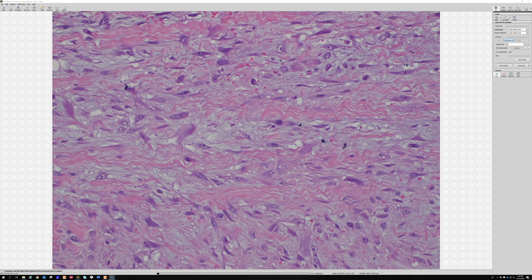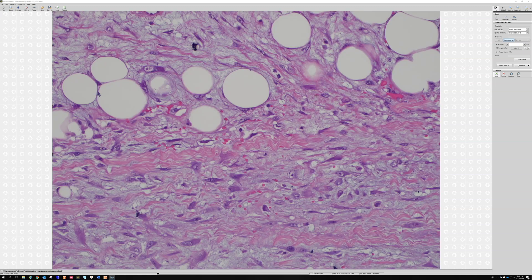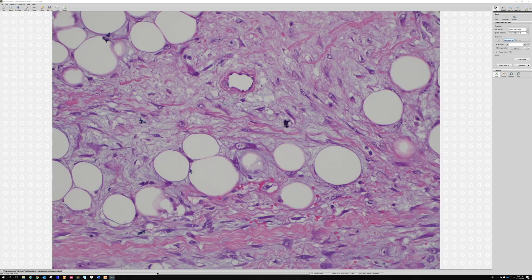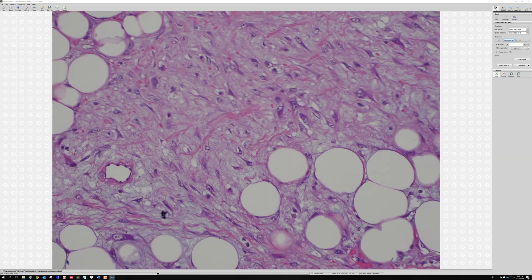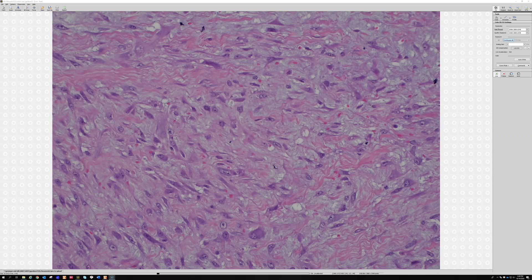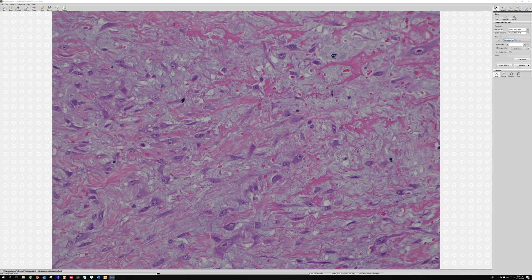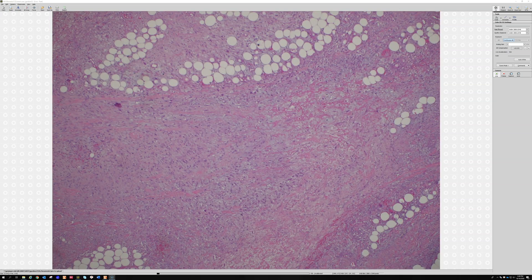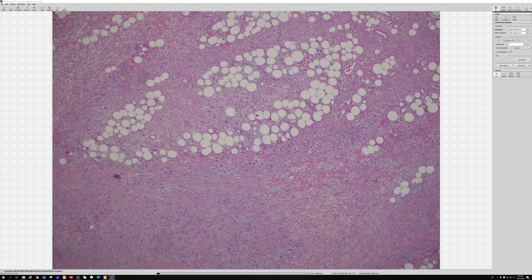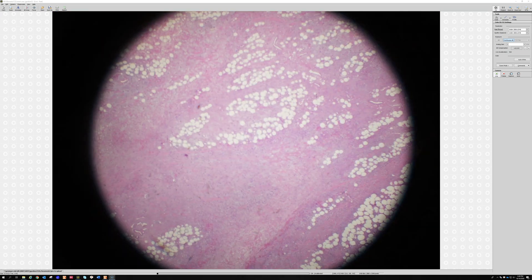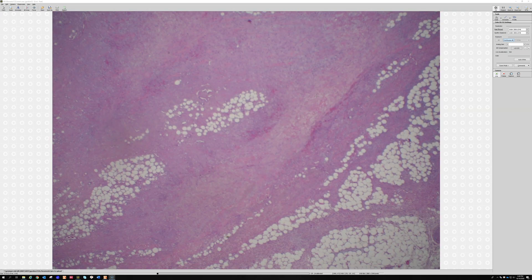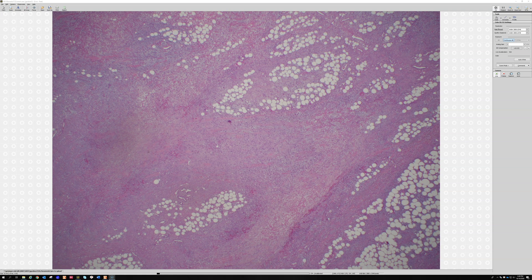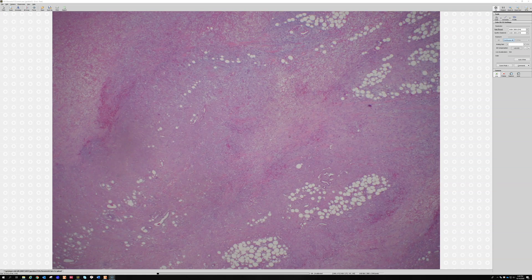We've also got background myxoid change and extravasated red cells. If you took those big cells out and just showed you this, it looks like nodular fasciitis. This is another form of fasciitis — very scary because it looks infiltrative and replacing the fat, but this is one where the periphery looks like fasciitis.